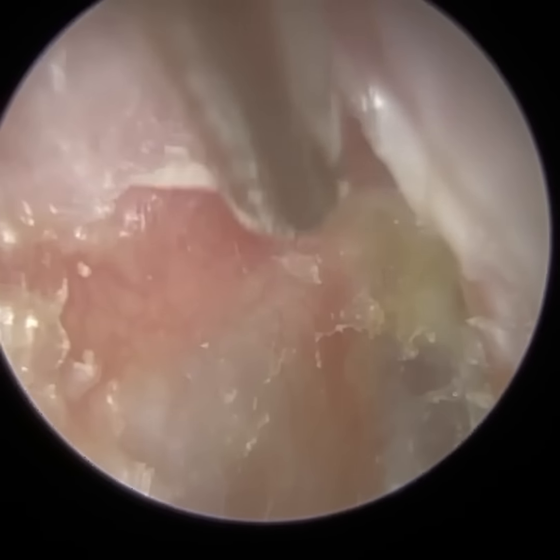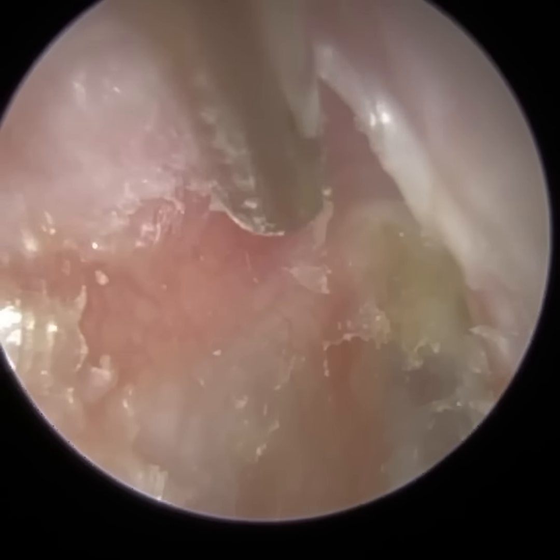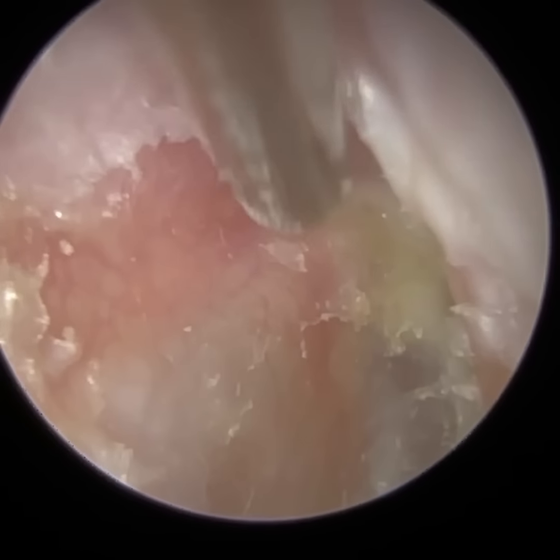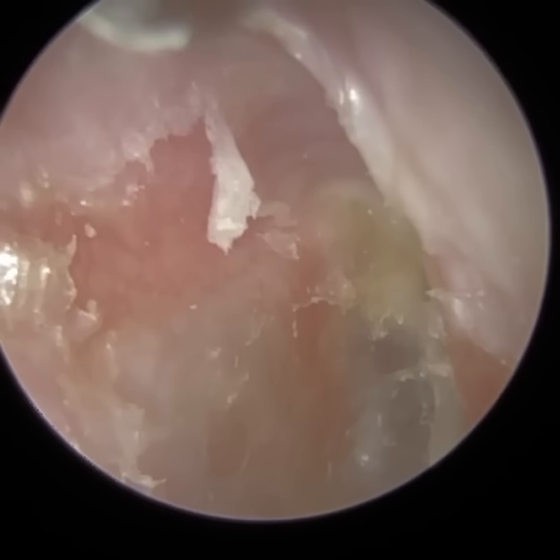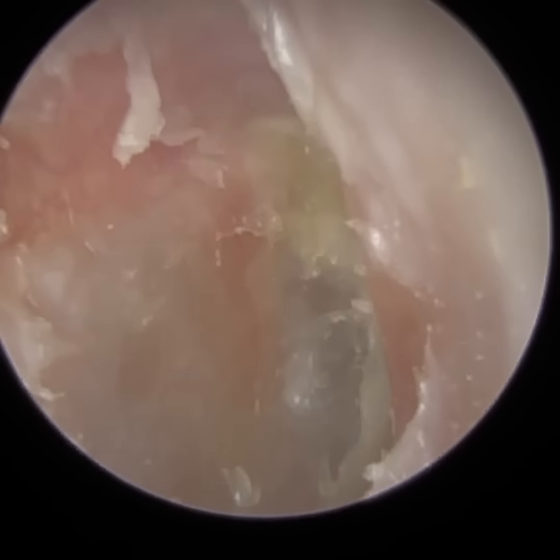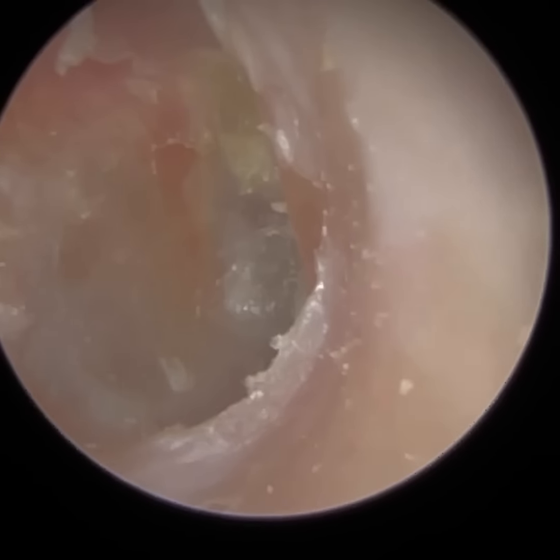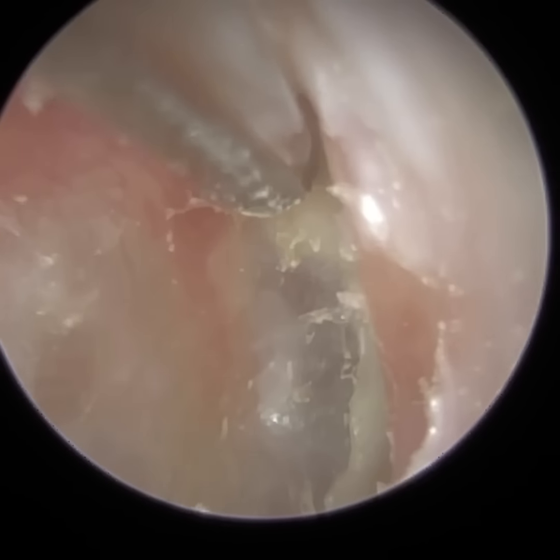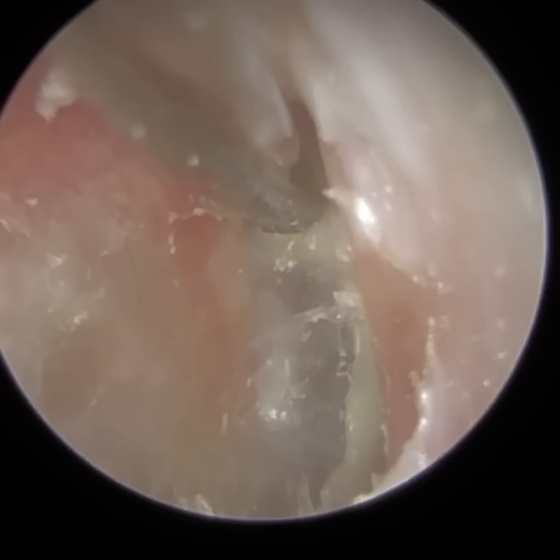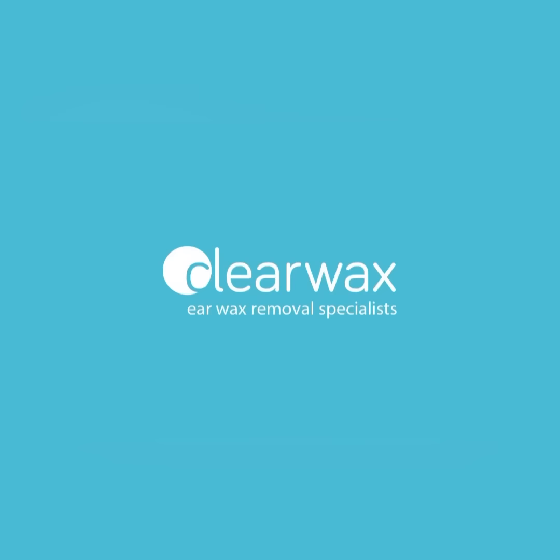So I was hoping to go to the top. I thought if I can peel this away, it may also then peel downwards to the top right of the eardrum. You can see there's a bit of skin there still left, we call that the anterior superior quadrant of the eardrum, just to the right of the hammer bone, the malleus. It's very difficult to gain access in there, but I think I managed to get a little bit out. We shall have a look. And by angling the fine end, I'm just creating more space. And I think I left it, and the patient found it slightly uncomfortable.